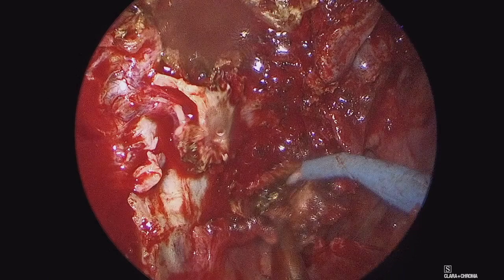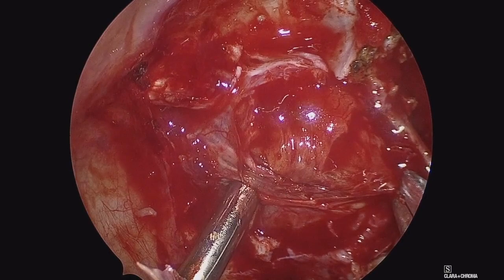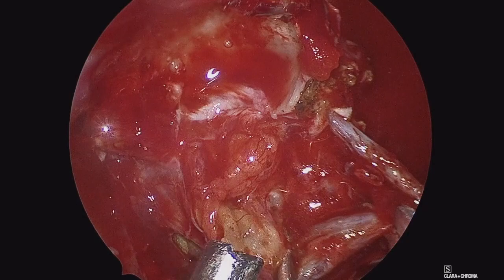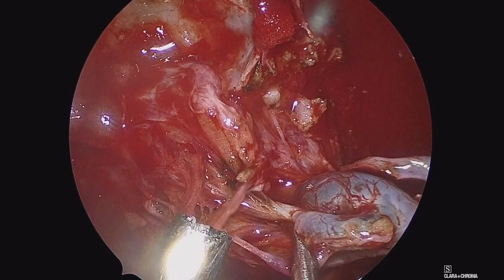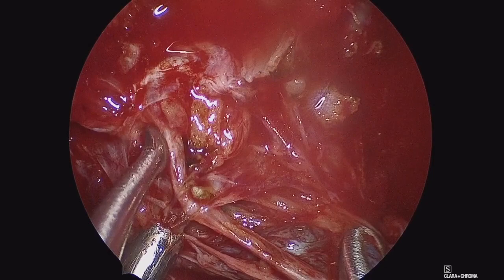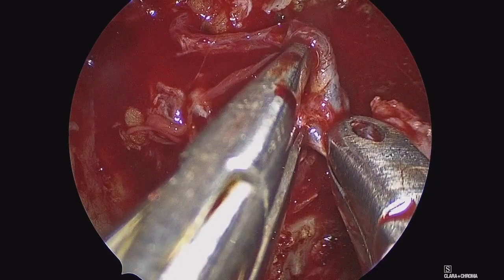We're now working inferiorly in the nasopharynx, coming around the tumor laterally and then inferiorly, before coming back out to the pterygopalatine fossa. We've better isolated the residual tumor here, working again through the combined right-sided Caldwell-Luc and endonasal approach. Dissecting out additional tumor amongst the fat of the pterygopalatine fossa and identifying the internal maxillary artery lateral to the infratemporal fossa. Although this has been well embolized, I do typically like to clip or cauterize this to ensure no residual bleeding postoperatively. Here we are isolating that artery, pulling it from the infratemporal fossa into the pterygopalatine fossa through our combined approach and placing clips across it.